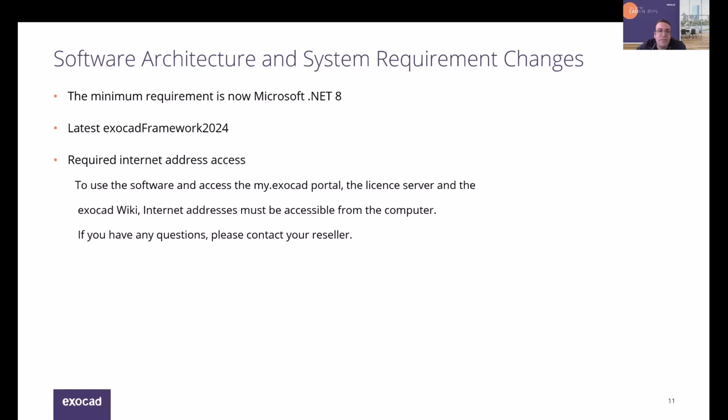Of course, we keep updating the software on the back end to be compatible with the latest Windows environment. The current .NET version requirement is .NET 8. Framework file: if you're not familiar with the installation process, your reseller installs some Microsoft prerequisite files, and those are packaged together in an exocad framework file. The version of that is currently 2024, and it gets installed prior to installing the DentalCAD build.